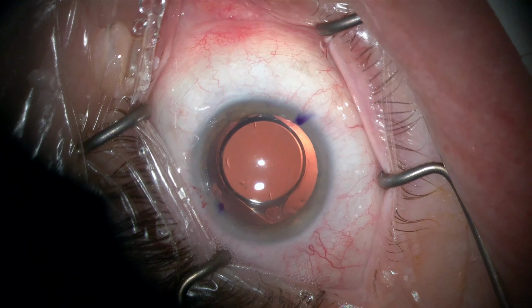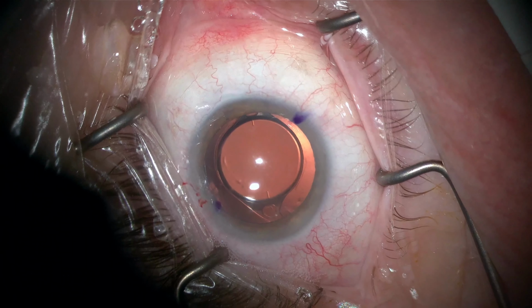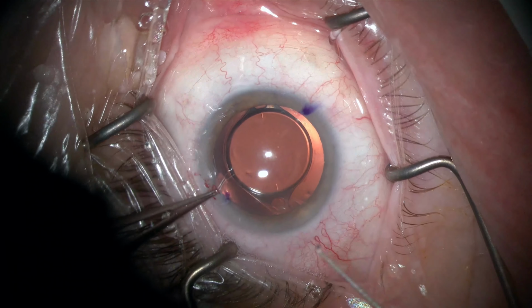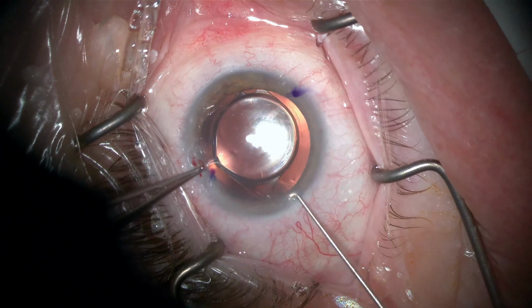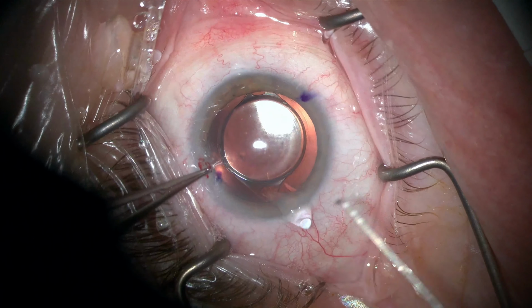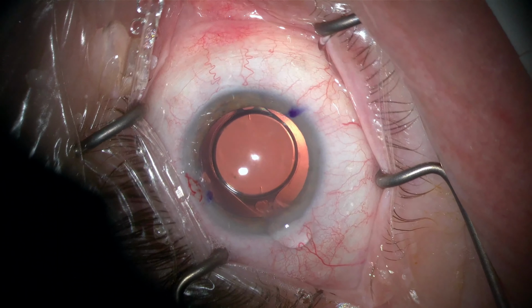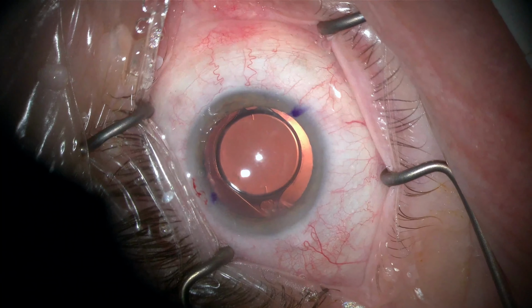Here, I didn't want to make an additional incision to induce any further astigmatism, so I used a Sinskey hook to open my prior incision. And since this is only 3 weeks out, the incision opened quite nicely.